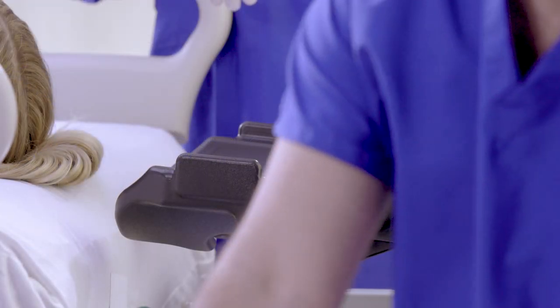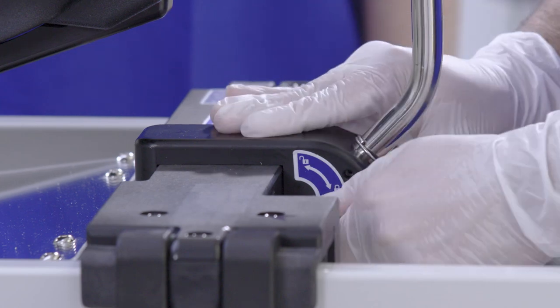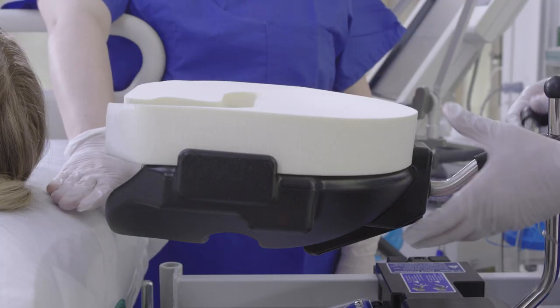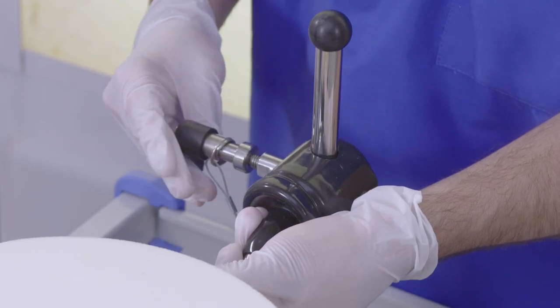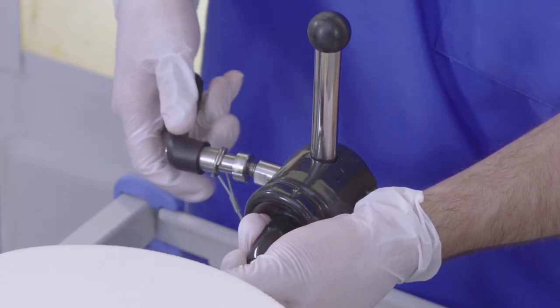Next, place the face cushion onto the head positioner. Make sure the lateral slide is locked. Adjust the height of the head support so that the top of the face cushion is even with the top of the mattress. Finally, lock the ball joint in place by turning the handle clockwise, and then remove the handle.